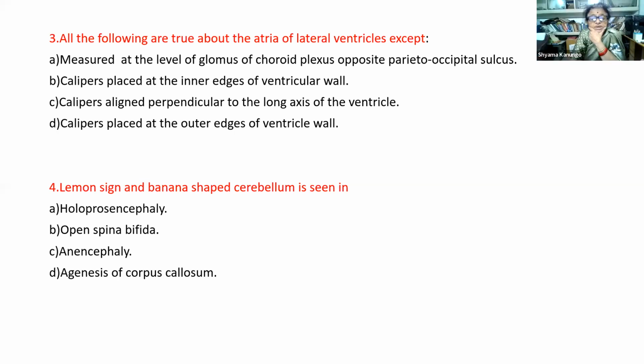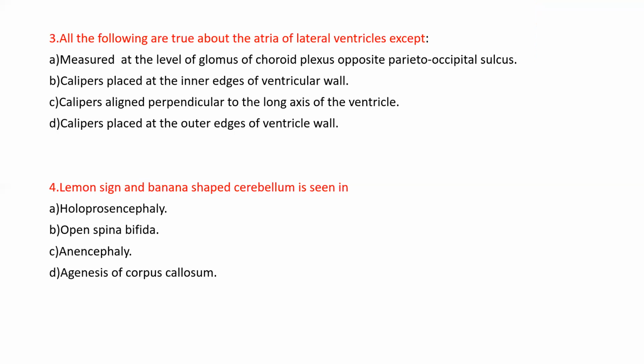Question 4, chat box. Open spina bifida. Yes, correct. Open spina bifida.